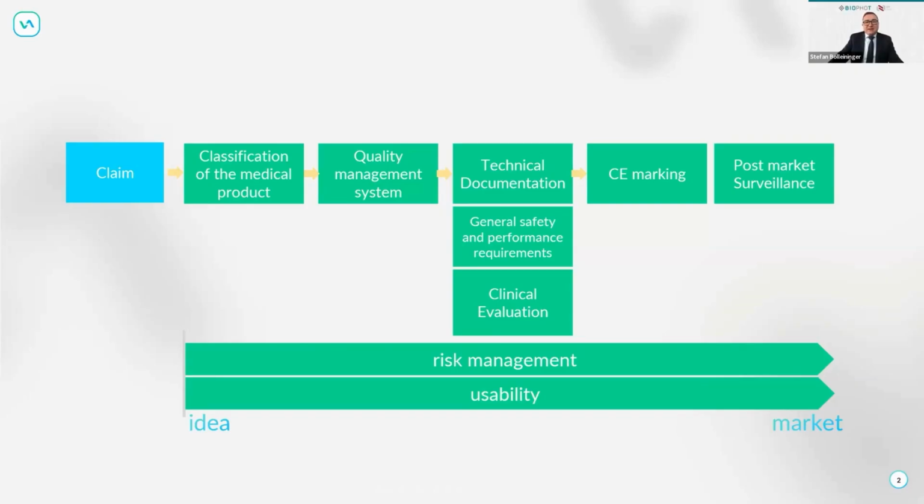That is one of the main things for which the regulation was created. And it also comes with the point about a medical device software or the AI. We have had medical device software since 2000-ish, and we've seen how that progresses. The AI is just the next step, where the visibility and traceability of results is even a bit less visible, a bit less traceable. However, it's a consecutive way from what we had in the past.